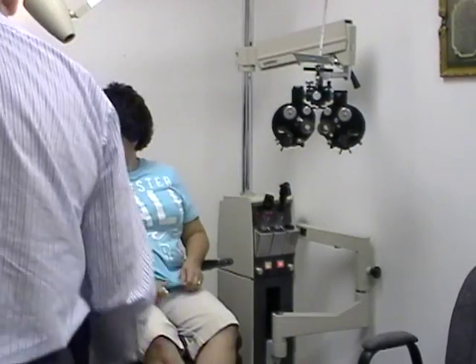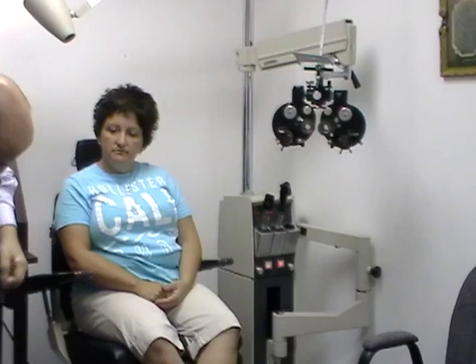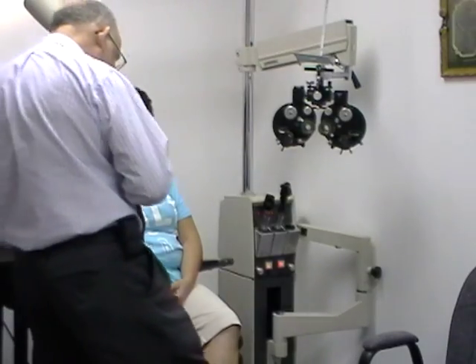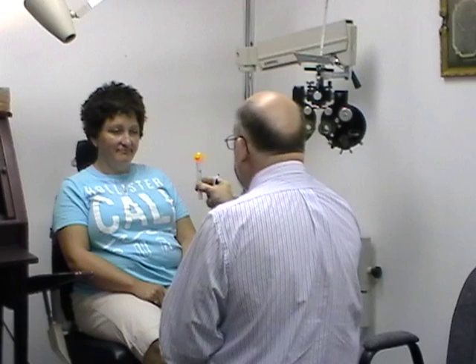This is Don, and Don is having some trouble with convergence. We're going to show what happens when we do a convergence test with a simple target, and then we're going to try using the microprism lenses to see what difference they make.